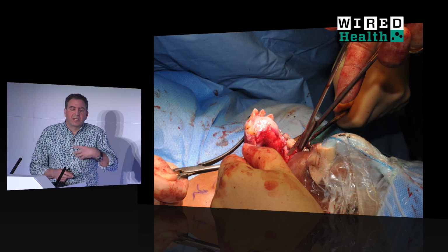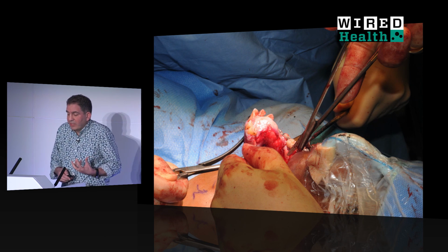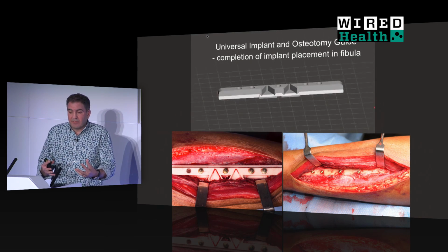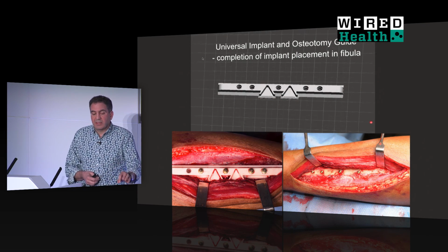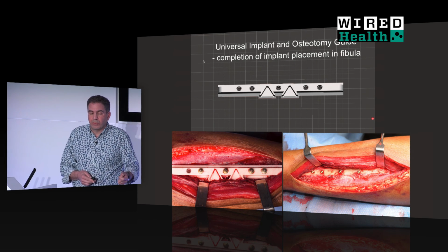Now, it's before lunch, and this is a bit of a nasty picture, so if you're a little squeamish, please just look away for a moment. So this is the patient, and the front part of the jaw is being resected. And this is what we need to replace. And here we have made and prototyped and 3D printed a guide that's fitted onto the leg. Dental implants are being placed through the guide into the leg that's going to become the jaw.